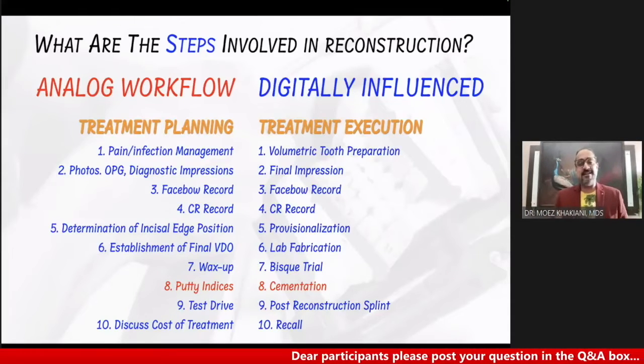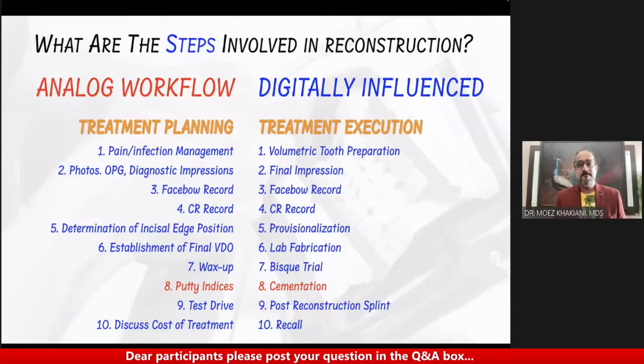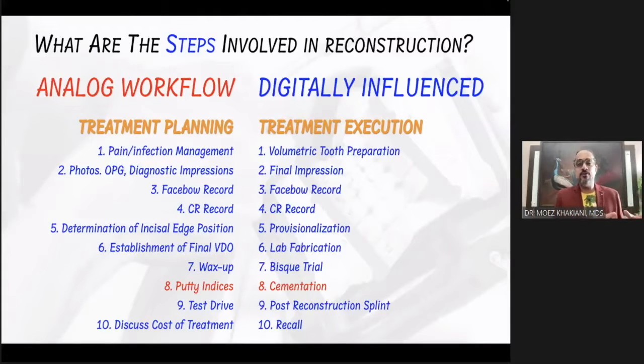But every other step, friends, is digitally influenced. So you can understand how much has changed in dentistry. So much of the work that we used to do in the analog protocols with plaster, with stone, with cast, with mountings, with articulator can be to a great extent digitally influenced.